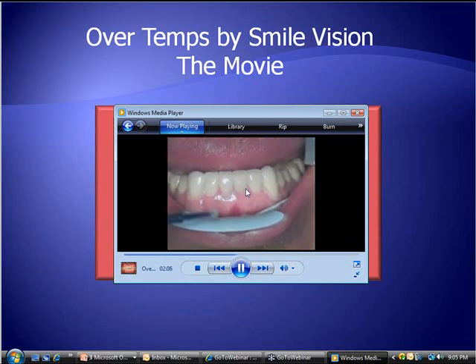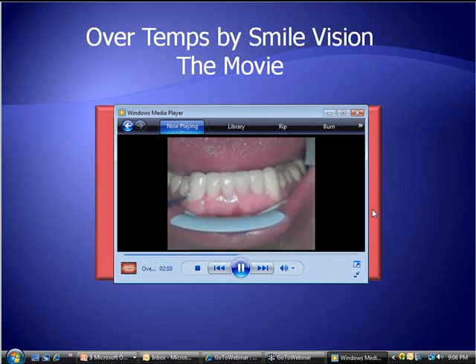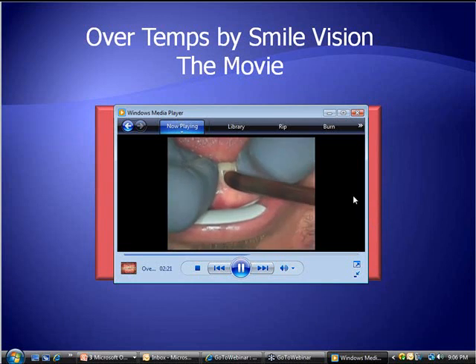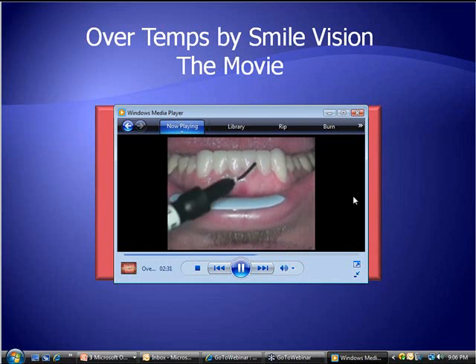This entire case was done in the morning. Cleaning up the excess — the more you clean up now, the less you clean up later, and it's much easier when it's soft than when it's been cured. Spot tacking it down again. And if you have a little void, you can take some flowable composite and just bead the area that has the void in it and cure it — seals it off very nicely.